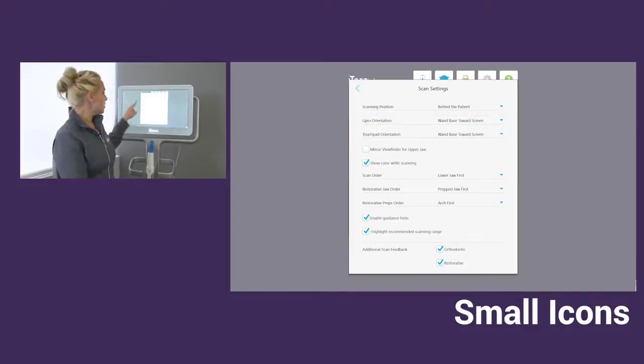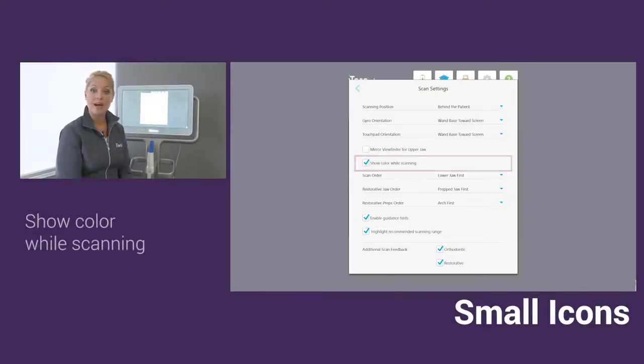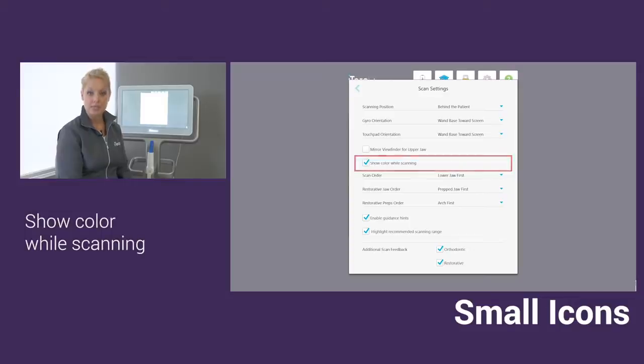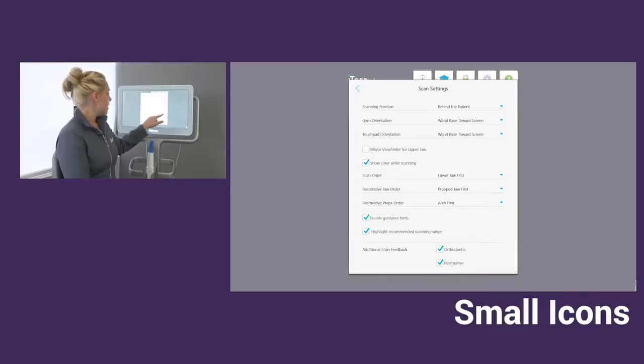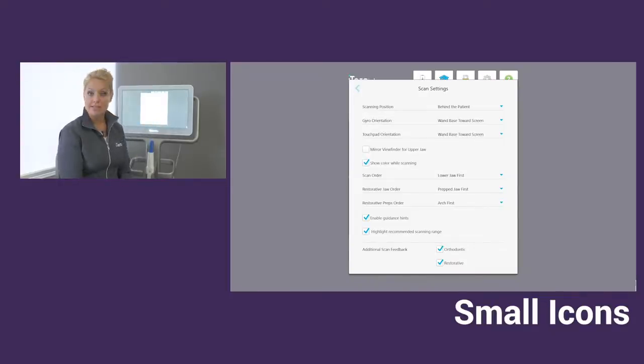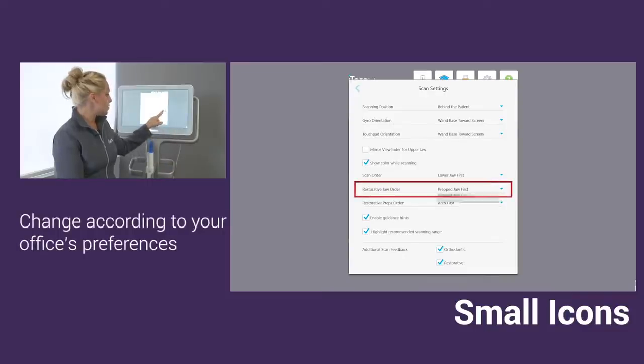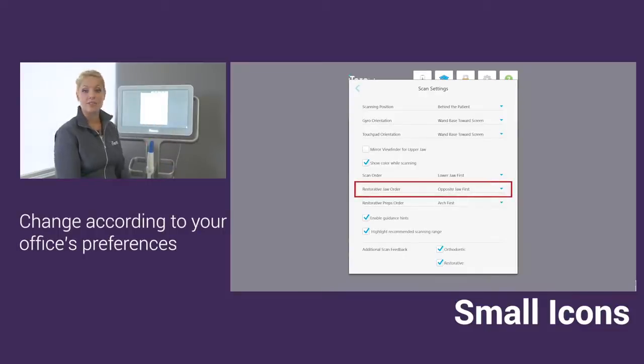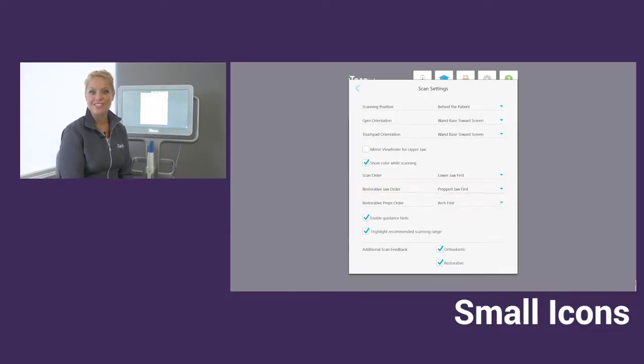You'll notice there is an option to show the color while you're scanning. If you prefer to see your model in color while you're scanning, you can set that in here. And then down below for the restorative jaw order, typically you'll see that the restorative order will be set to the opposite jaw first. You can drop down and choose prep jaw first, depending on what's best for your office.